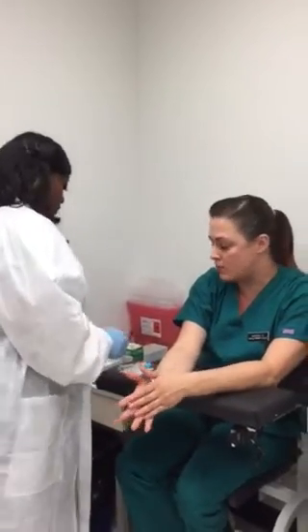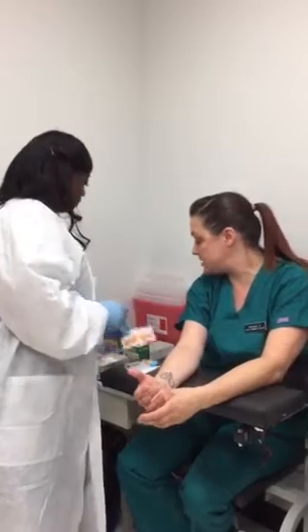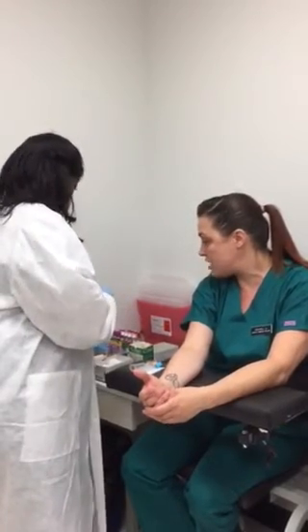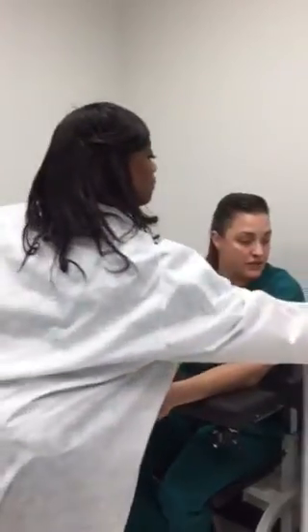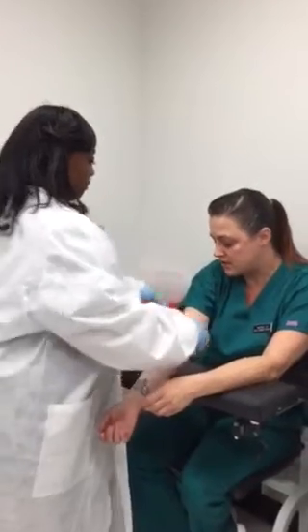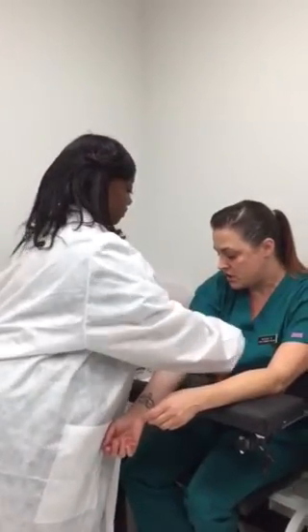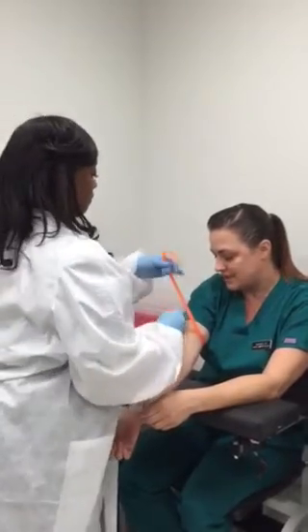The ALT and the AST can both go in the same tube. After she preps her station for the puncture, she's going to apply the tourniquet so that she can pick a good site to do the puncture. Remember to only leave the tourniquet on for no longer than 60 seconds.